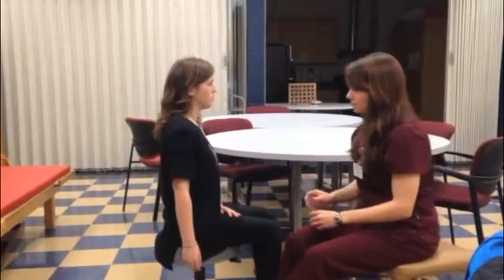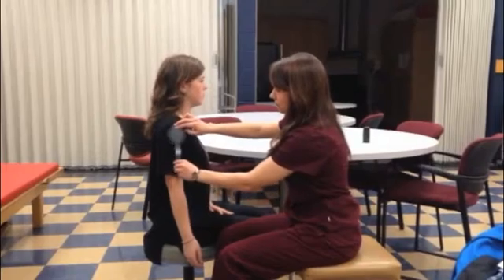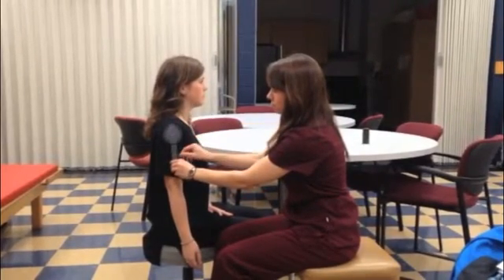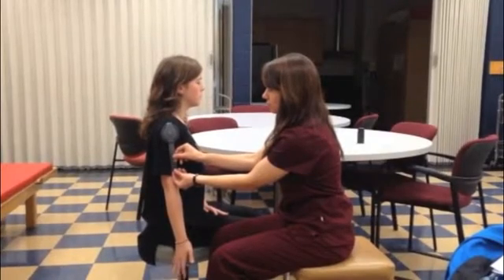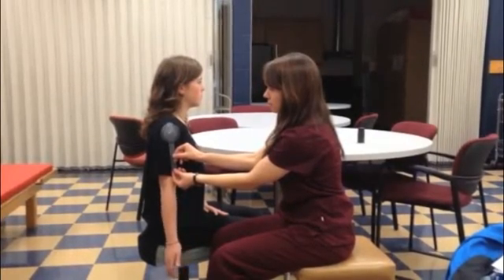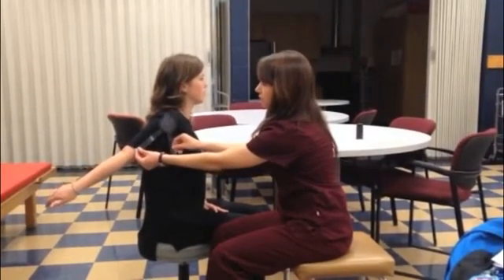Ask the patient to actively raise the shoulder backwards and observe for muscle contractions, signs of exertion, and any abnormal substitutions. Feel for the patient's acromion and place the axis directly under the acromion process. Record the starting degree range of motion. Ask the patient to perform the same movement as before, and move the movable arm in line with the humerus.